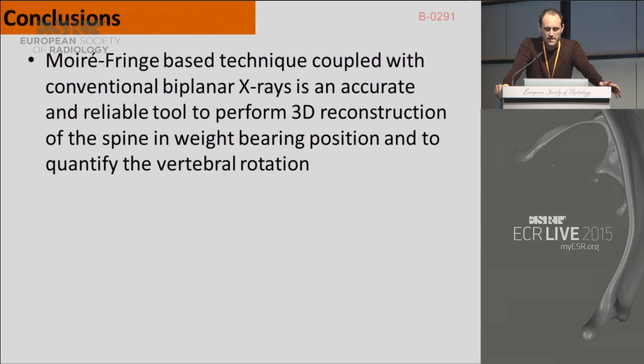But we can conclude that Moiré-Fringe technique and the spine reconstruction using biomod, it's an accurate and reliable tool to perform three-dimensional reconstruction of the spine in weight-bearing position and to quantify the vertebral rotations.